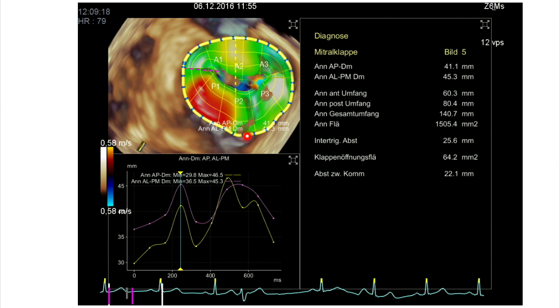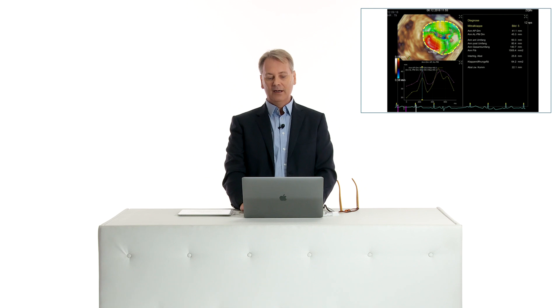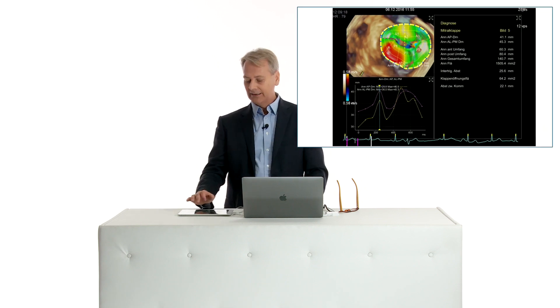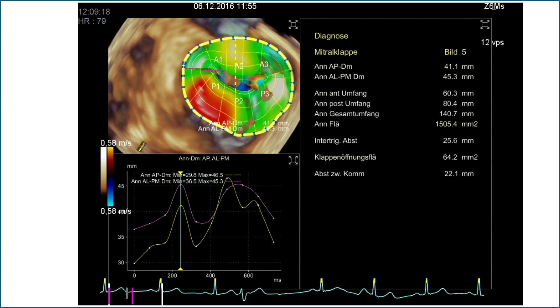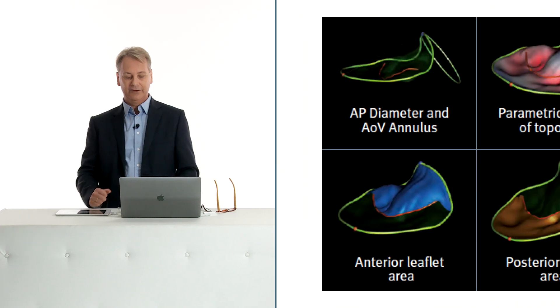Red indicates prolapsing structures — a nice way of taking one image, giving it to the surgeon, and telling them this is the problem with the valve. This form of calculation is now being more and more applied in 3D systems. We do not yet know how these measurements play a role in clinical practice, but as time goes on there will be studies which use these measurements to make clinical decisions.